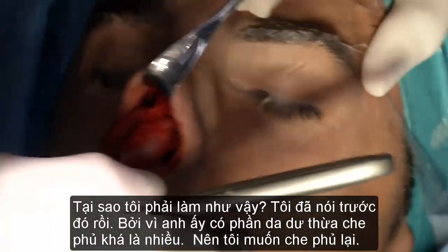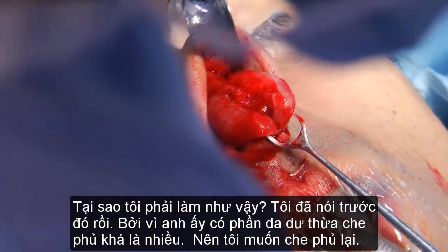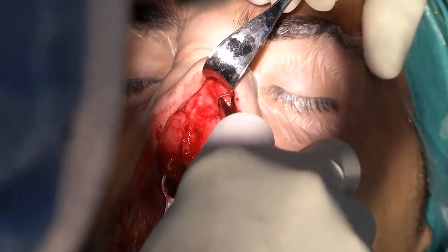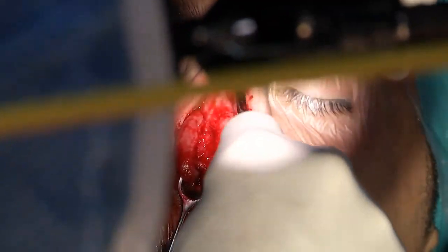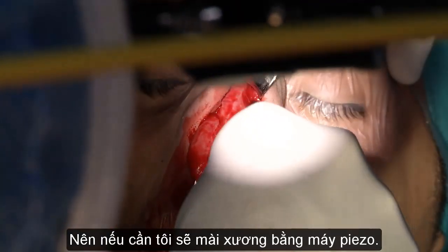Why do I do that? I said before, because he has a large redundant skin envelope, so I wanted to redrape. And maybe, as I think it was Garifaglia who said this, he has bone asymmetry, so if I need to do it, I will do his osteotomies by piezo anyway.